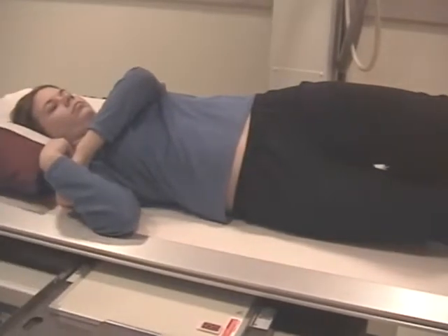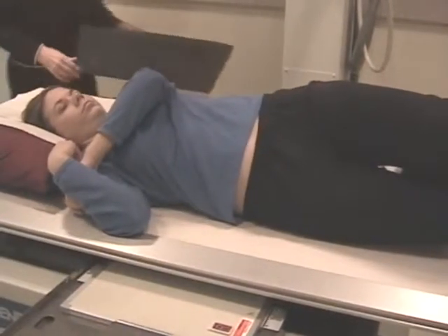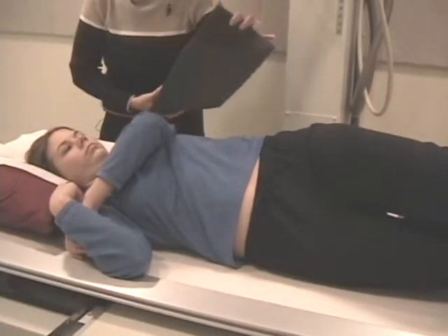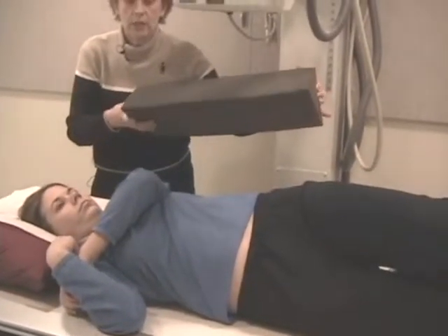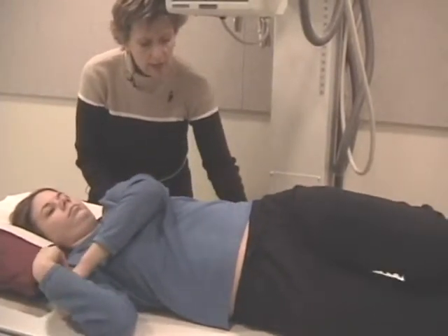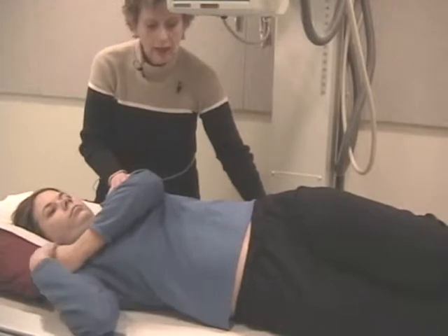And when you get your speed up there, you wouldn't have to use a sponge, but students tend to be a little slower than techs. I've pulled out a 14 by 17 positioning sponge to help that patient be more stable. And you just secure that sponge underneath them and then let them relax.